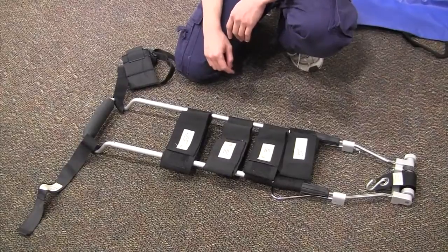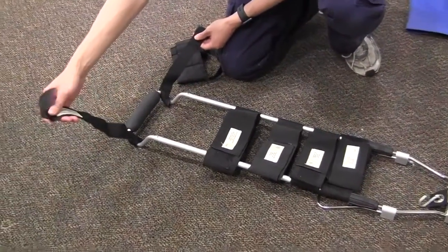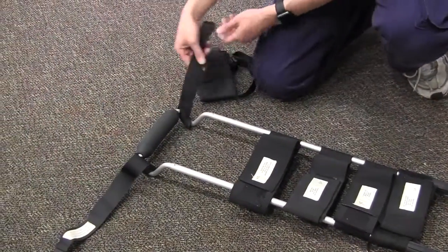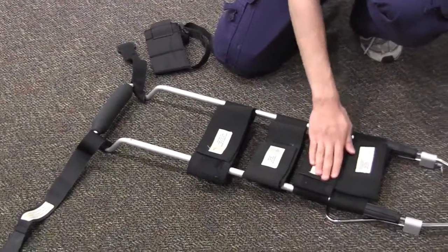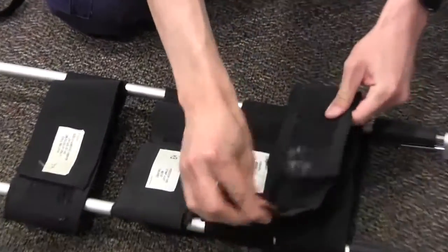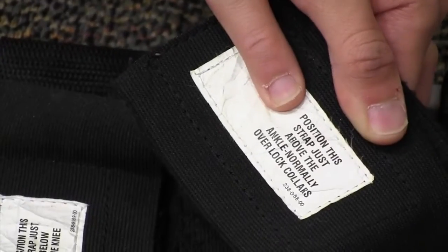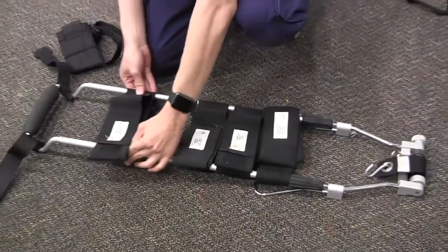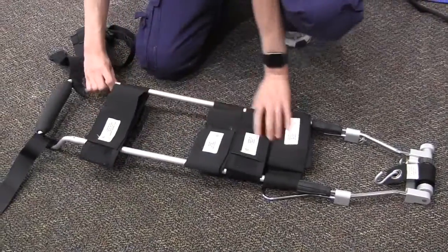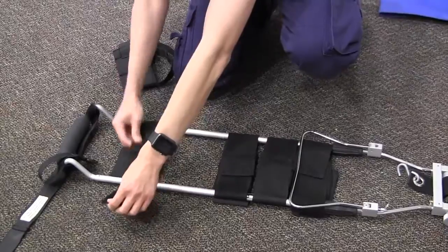Now let's talk about what's on the traction splint. At the top, these thin straps are the ischial strap. These four large straps are the support straps — each of them open up and have numbers as well as positioning guides for placement on the leg. Each of them are adjustable in position and can even be removed if needed.